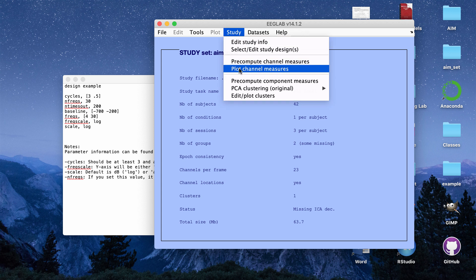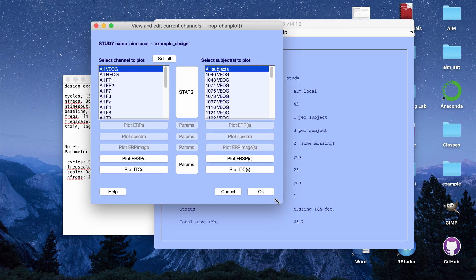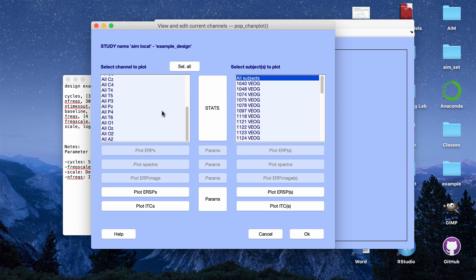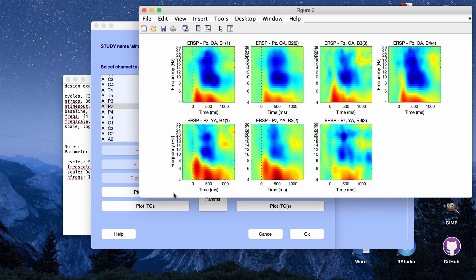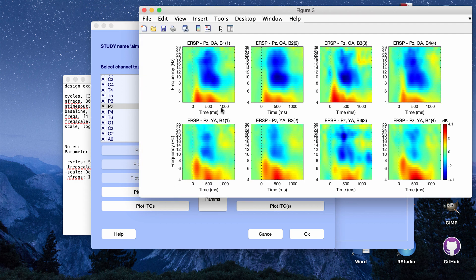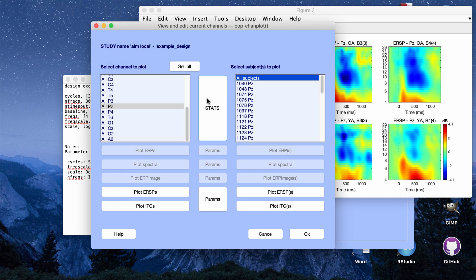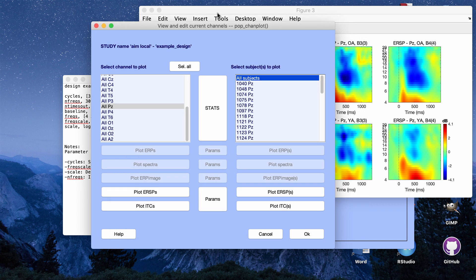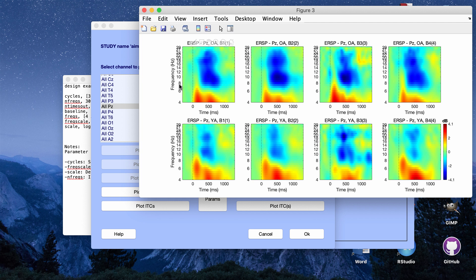Go to Study and click 'Plot Channel Measures'. That opens a window giving options to select different electrode channels and subjects. For example, I'll look at PZ for all subjects and click 'Plot ERSPs', which produces eight time frequency plots — four conditions for older adults in the first row and four for younger adults in the second row. This gives you the raw time frequency plots. If you want to see significant statistical clusters, you can go into Stats and choose parametric or non-parametric options for finding significant clusters or pixels.